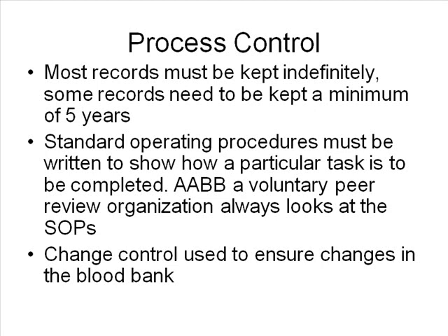So if the patient is alive, when you think about it, has antibodies or has been given units of blood, those records should be kept indefinitely, either on microfiche or in a card system. Many labs are going to computer now, where they can just look in the patient file, computerized, and the patient comes up. All right? But things that are paper records, for instance, that are basic cross-matching, minimum of 5 years.